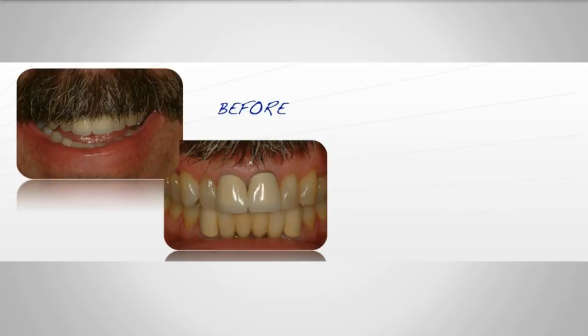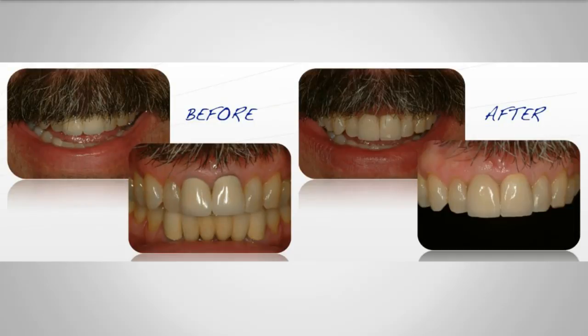Here is Frank prior to treatment, and here are the restorations afterwards. So you can see certainly the soft tissue profiles are very clinically acceptable. You'd really have to look not to know that that was an implant restoration. He's had this about 3 years now. I just ran into him in a store the other day and had him retract his lips so I could look at it. He's doing quite well. So that's an example of soft tissue preservation.